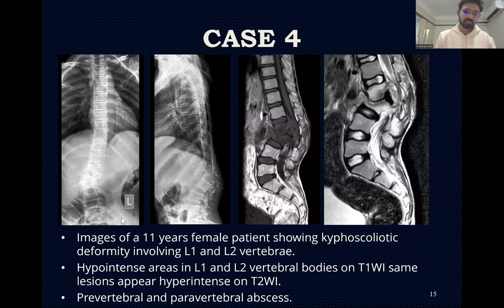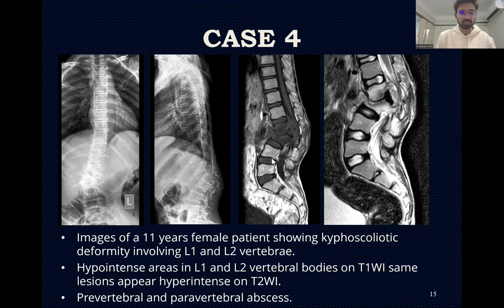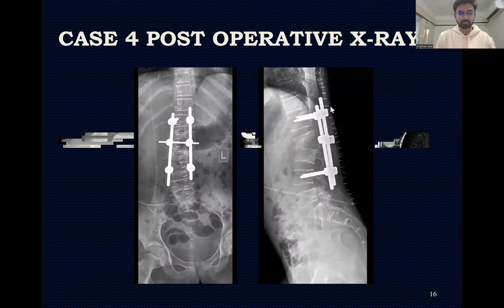Case four: Images of a female patient showing kyphoscoliotic deformity involving L1 and L2 vertebral bodies. Hypointense signal in L1 and L2 vertebral bodies on T1-weighted images, with the same lesions appearing hyperintense on T2-weighted images. Pre-vertebral and para-vertebral abscesses are noted. Post-operative X-rays of the same patient are also shown.